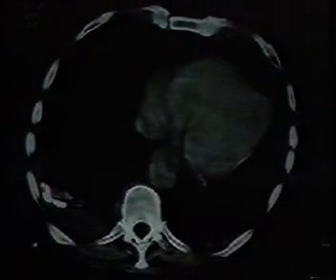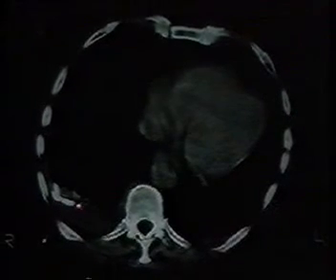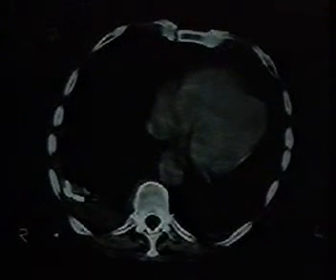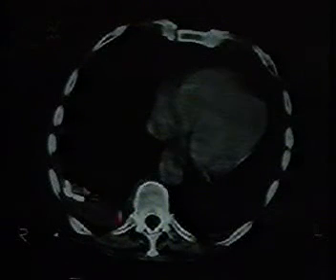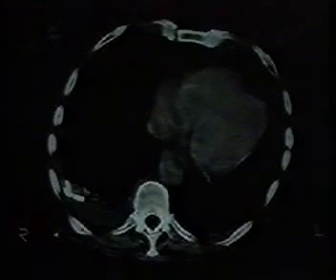And using a trocar technique again, place a pigtail catheter into the collection, aspirate the infected fluid, which in this case turned out to be a staphylococcal empyema, and here's the follow-up CT scan obtained 8 days later with the pigtail catheter in the pleural space. You can see a very small residual pleural fluid collection, some hypertrophy of the extrapleural fat, and a little bit of adjacent collapse of the lower lobe.